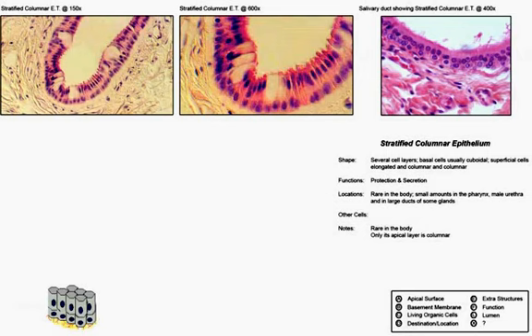Here is an even rarer type of tissue, the stratified columnar type. You can see some goblet cells. This too would be found in salivary ducts, protecting against some of the components of saliva that's being produced and secreted into this tubing. So also a very rare tissue, very rare occurrence to see cuboidal or columnar stratification. And since it's so rare, it wouldn't be a primary focus. This is sort of what we're trying to teach is the norm, and this is a rarely found tissue. It's only in certain parts of certain areas of the body.